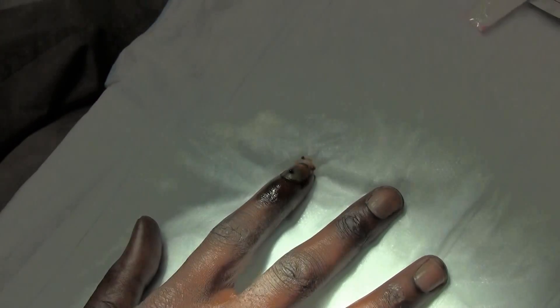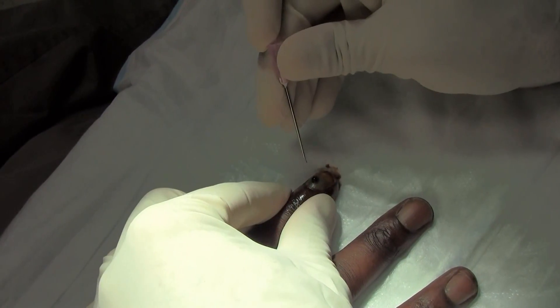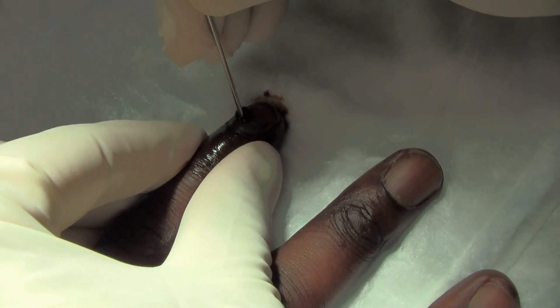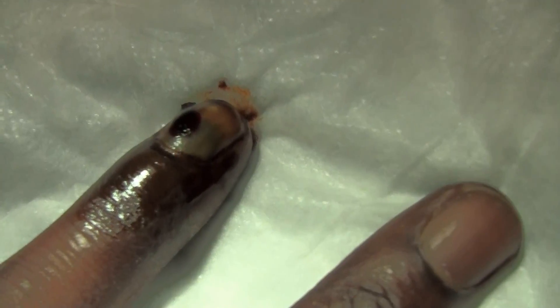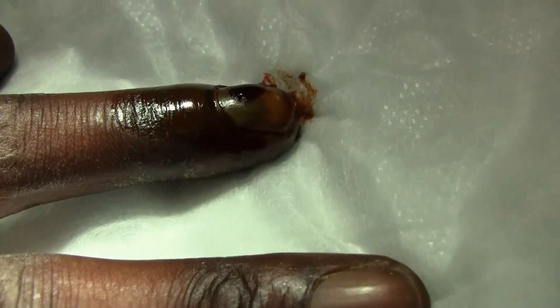I think that did it. And what you might do is you can spin it a little bit just to kind of make the hole bigger. Now that he's got the blood out there, it's going to feel a lot better.